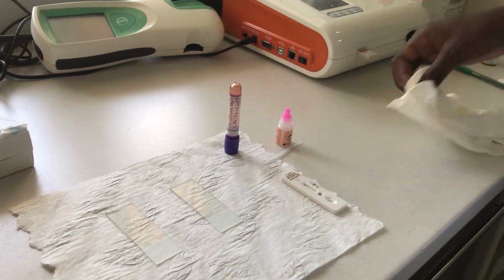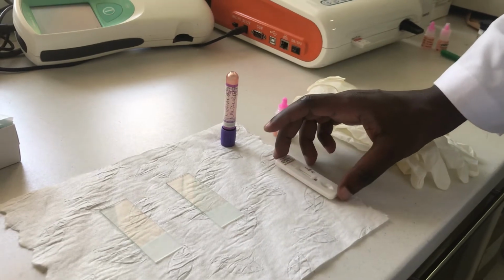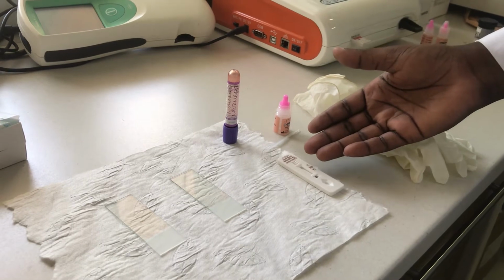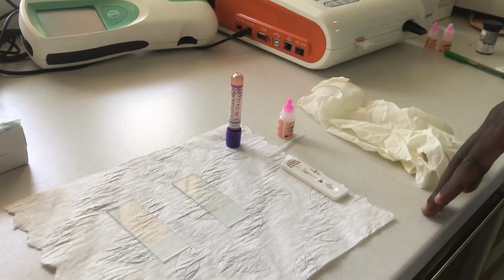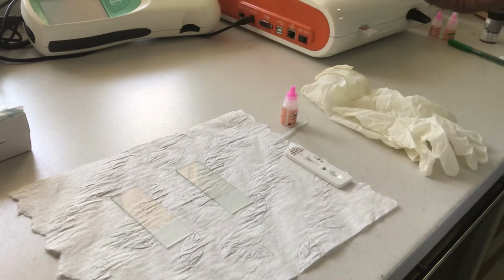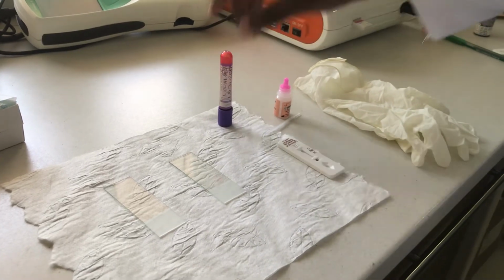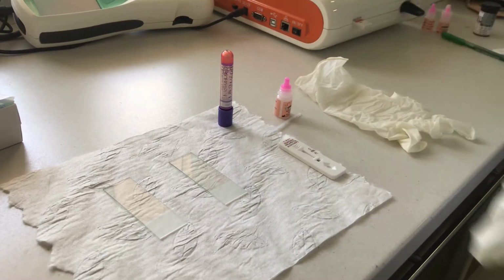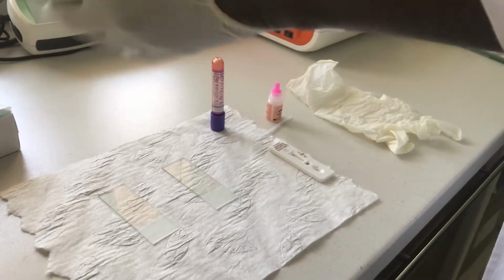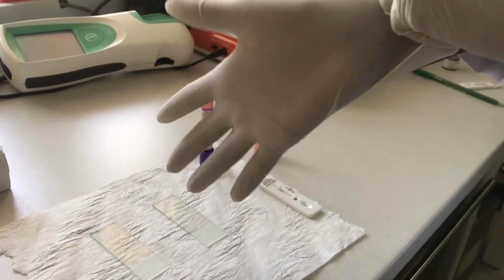So what do you need? You need your pair of gloves. You need your cassette malaria RDT. This one is specific for all the species. It does all the 4 species: falciparum, vivax, ovale, malariae mainly. So we want to see how we can do the test. You have your gloves on as a safety precaution.